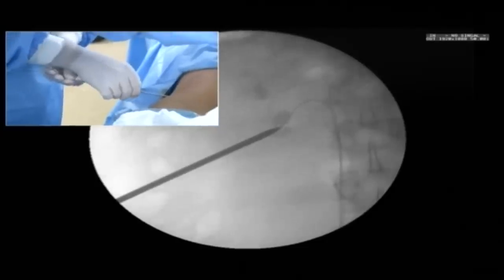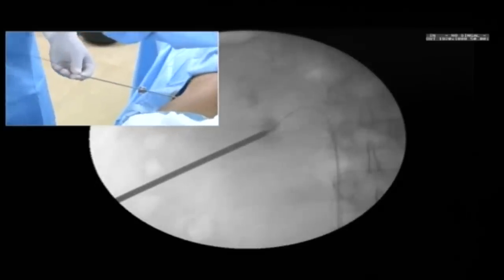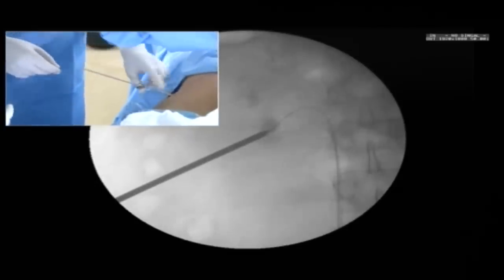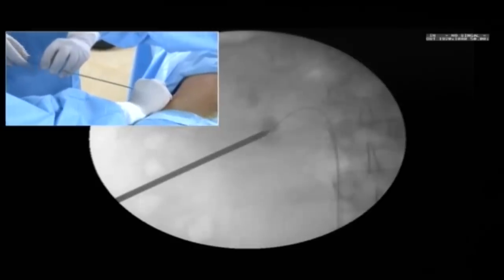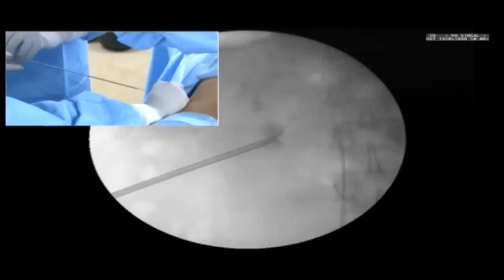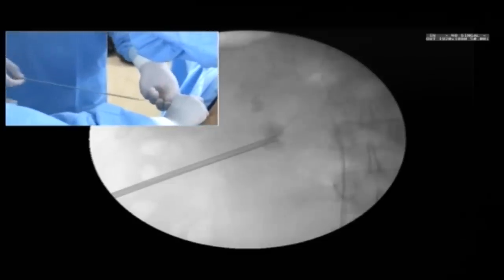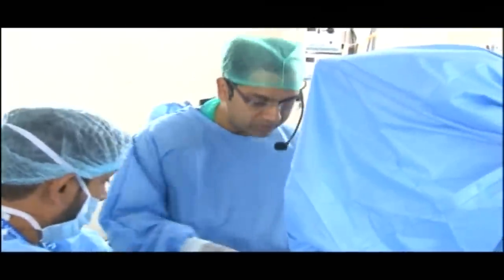Dr. Kukreja, what size nephroscope would you use? In this case we will use a 7.5 French nephroscope. What would be the working channel? It's 2 French and 3 French — one is for the working channel, the other is for the irrigation. Now can you show the surface once again? Sister, put saline from below. Now you see the clear fluid coming out? Very good, excellent — this is how it should be.